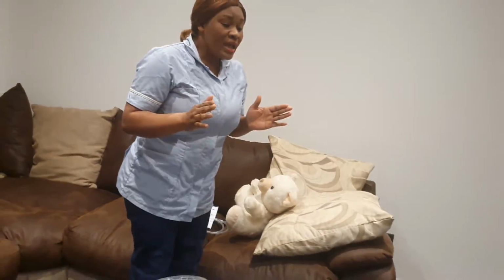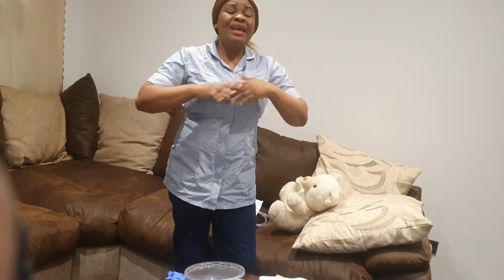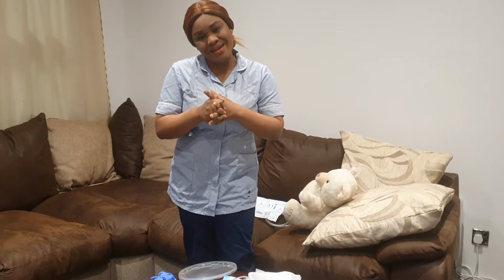Catheter sample of urine. So assume your assessor can tell you, immediately you get there, "Assume you've checked for skin safety, assume you provided privacy, go straight to your patient." If that happens, just proceed to your hand hygiene. Though a lot of people say, "I get thrown off balance." No guys, that shouldn't really scare you, all right? Immediately she tells you that, the next thing to do is to go straight to your hand hygiene. So today I'll be going straight to my hand hygiene.